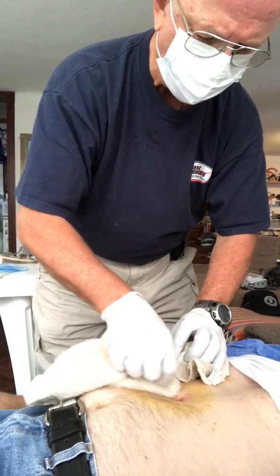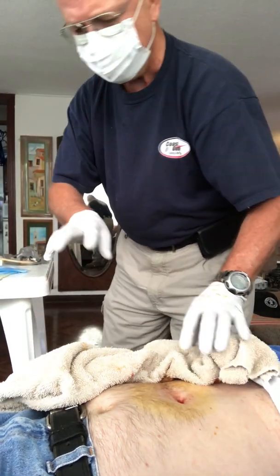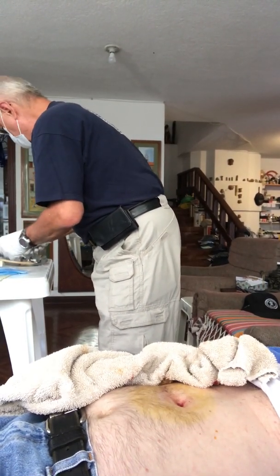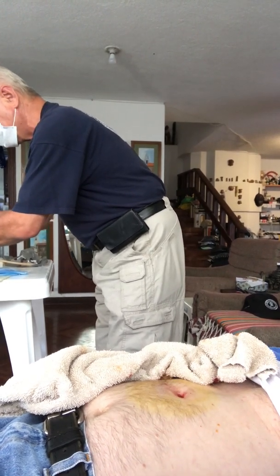It's a little bleeding, like we knew was going to happen. It goes all the way. Okay, now I'm going to clean it up again. It popped like a firecracker. Yep. Pop. Whew. You're done though. I mean, now it's just a matter of.